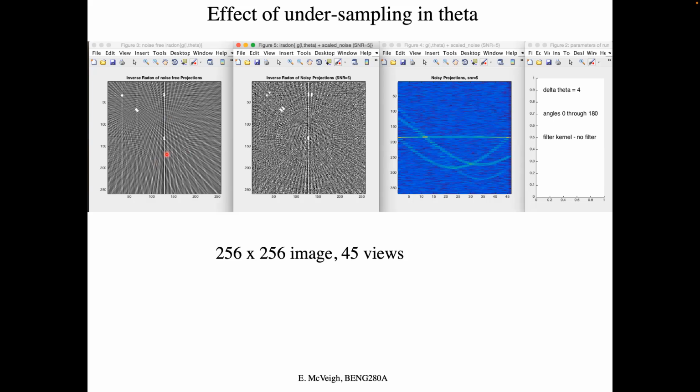Because it's undersampled. You can see the characteristics: we have all of these streaks, and these are those side bands. When you do the convolution back projection, you have a function that's a bump, and then you do the convolution and it makes those negative side lobes. You back project that. And out here, we don't have enough of them back projected in order to cancel out these wings from the back projections, so this gives us all of this artifact. In some places, there's a higher density, and so things look a little better, but not much.